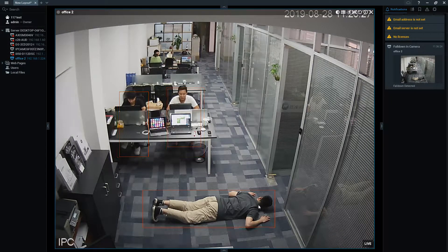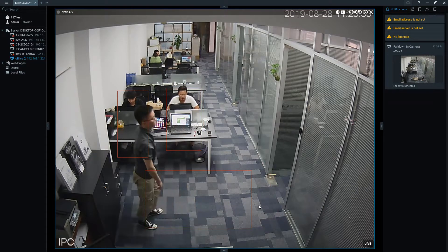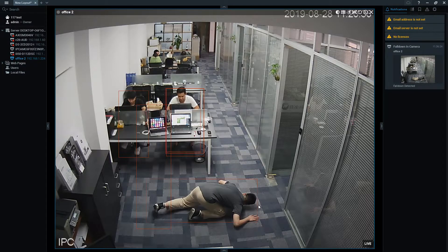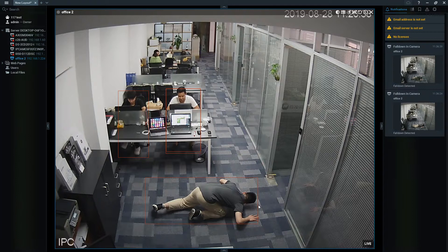Now we're going to try the second fall posture — falling with one knee. So if you fall down with one knee, the alarm also goes off because it is a fall.